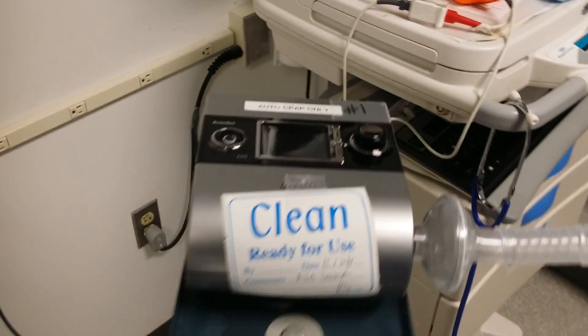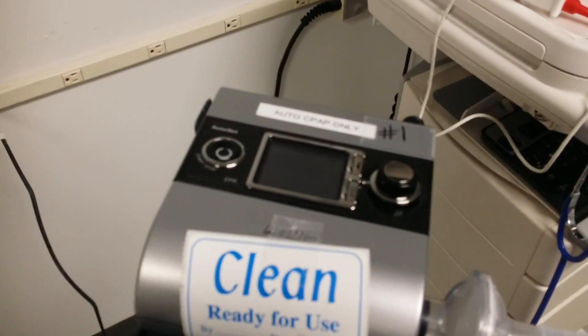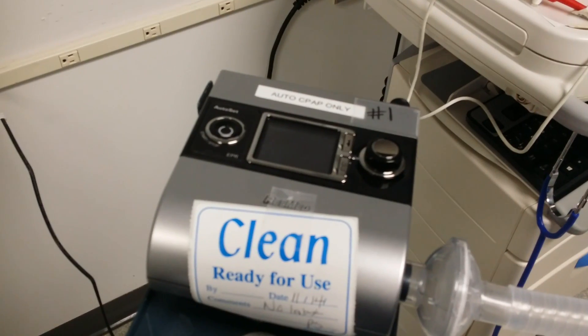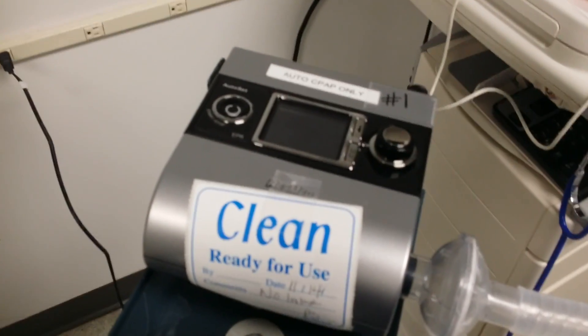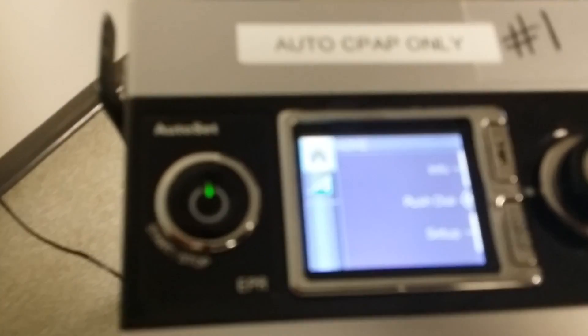This is going to be a tutorial on the setup for the ResMed S9 AutoSet, an auto CPAP machine from ResMed. This video is a tutorial for the clinician setup. Make sure you have it plugged in and you have power. When you have power, look at the LCD screen and make sure this is what you would see.